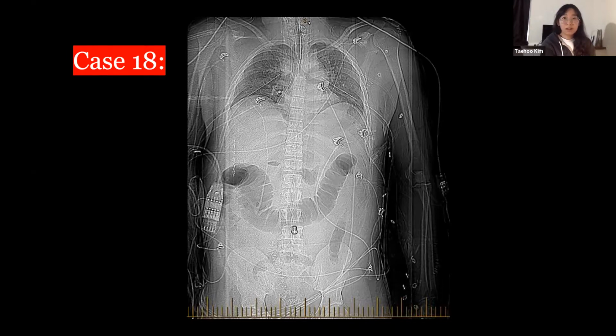But the common practice here is you just ask for CT abdomen right away, and we'll do a classic CT and look for signs of pancreatitis. Even if we say there are no radiological signs of pancreatitis, and there's a lot of elevated lipase and the patient has the clinical picture that goes with it, then you just treat.